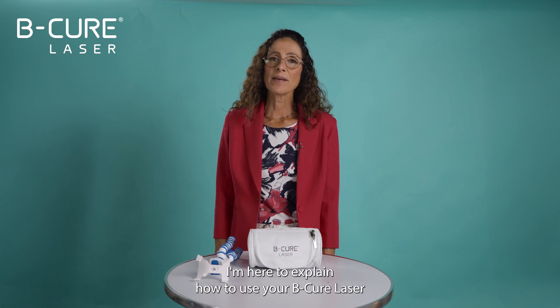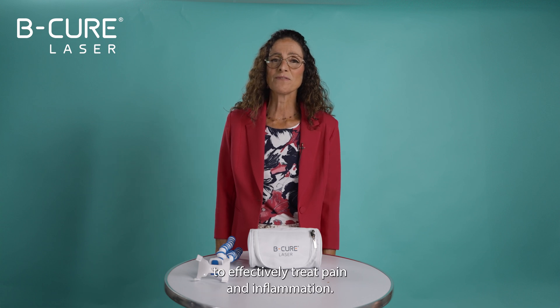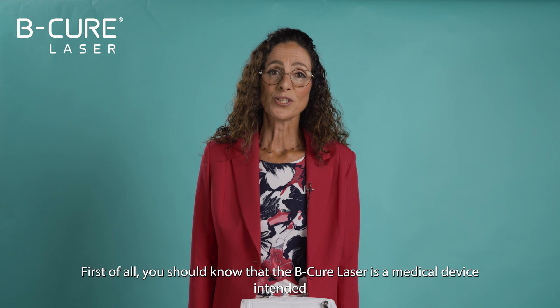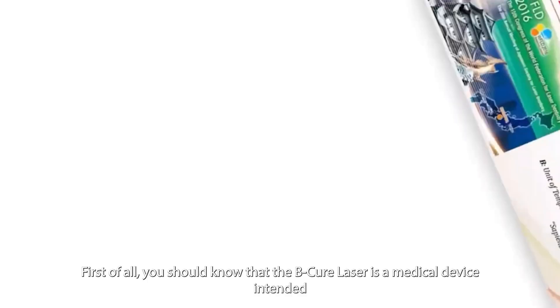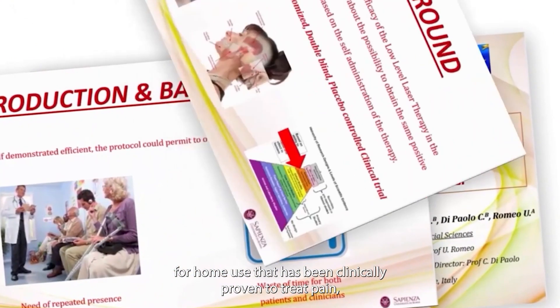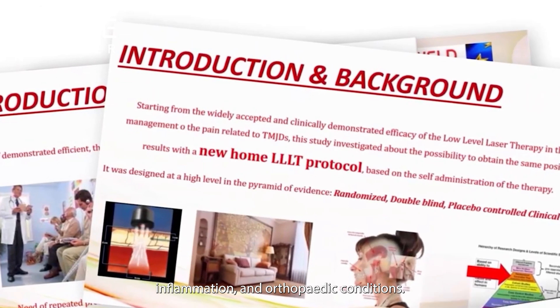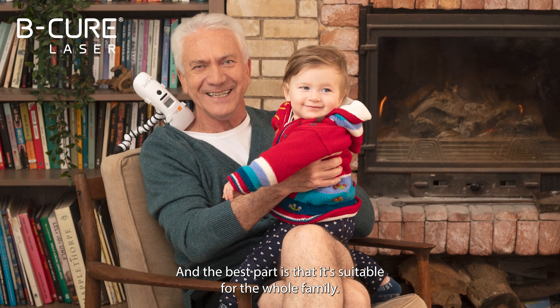Hello and welcome to BeCure Laser. I'm here to explain how to use your BeCure Laser to effectively treat pain and inflammation. First of all, you should know that the BeCure Laser is a medical device intended for home use that has been clinically proven to treat pain, inflammation and orthopedic conditions, and the best part is that it's suitable for the whole family.